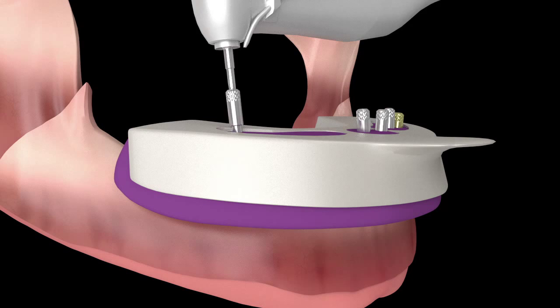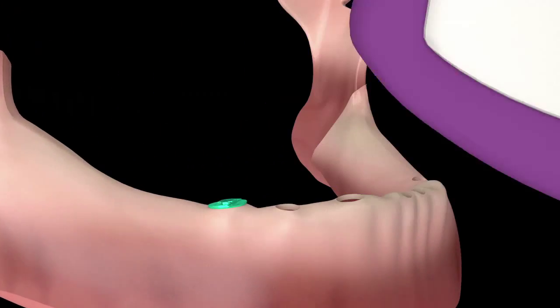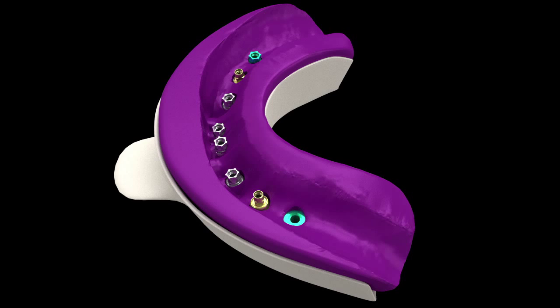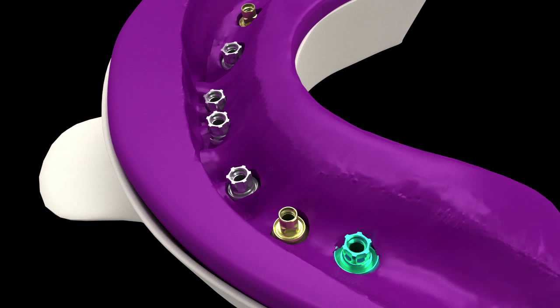Removal of the impression is a critical moment when the diverging copings can damage the accuracy of the impression. The tray is removed, and a base component has automatically detached before damage can occur. It is simply removed, and with a slight twist, reunited with the upper transfer in the impression. The indexing configuration ensures the maintenance of accuracy.